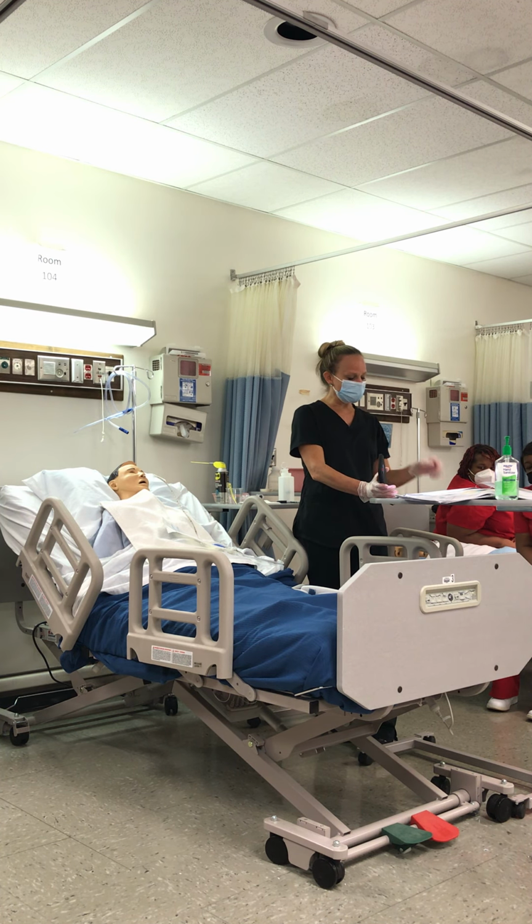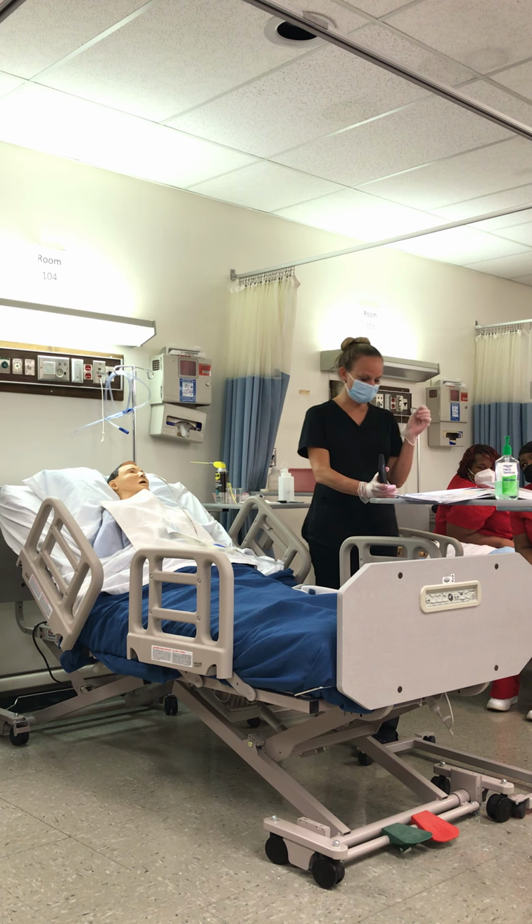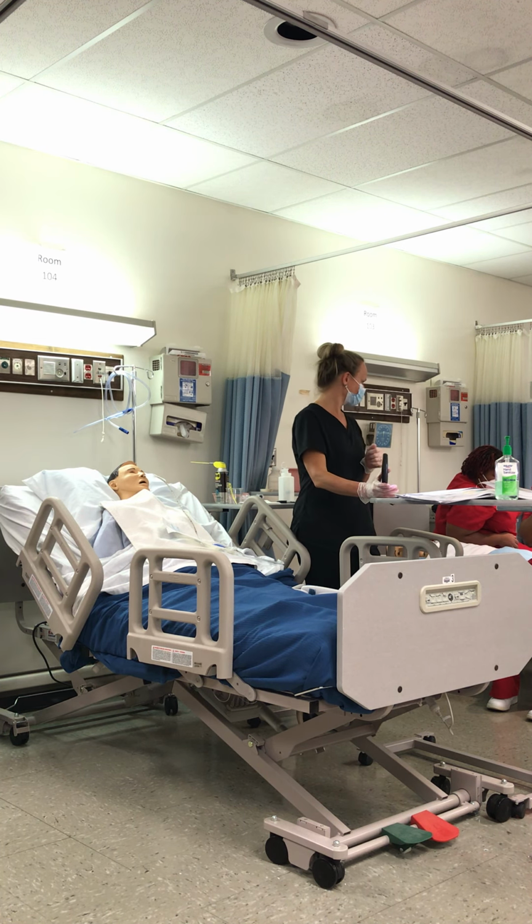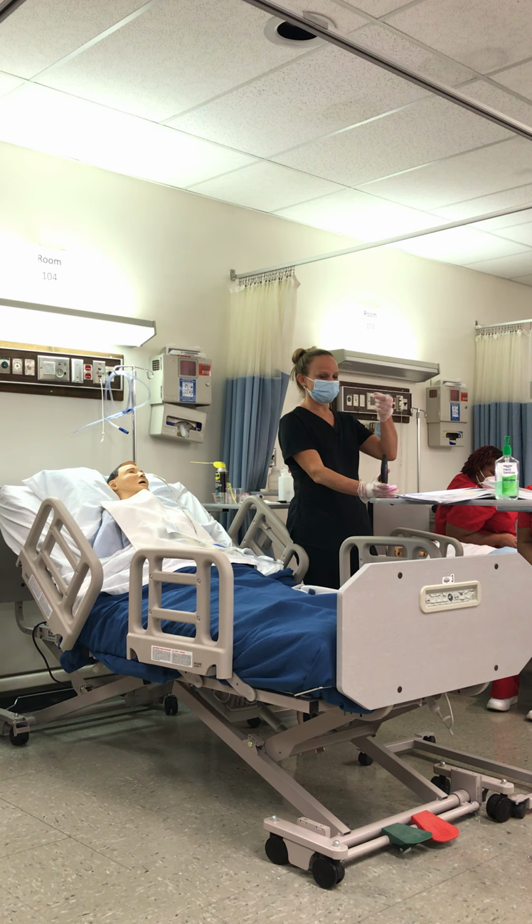So, if we're having trouble passing it, you can back off a little bit, but what's one of the first steps you can do before you retract back? This is in your steps. I went over it in class. Meet resistance, rotate the tube. Okay?